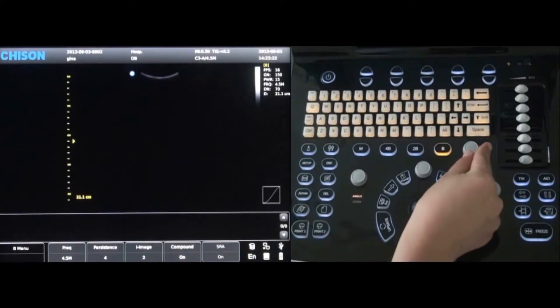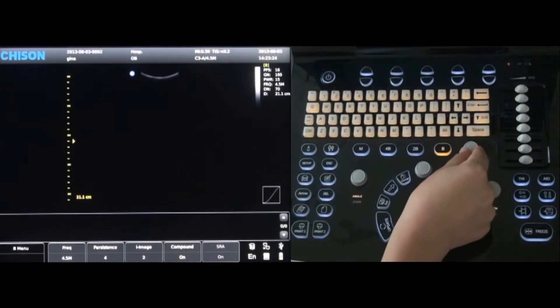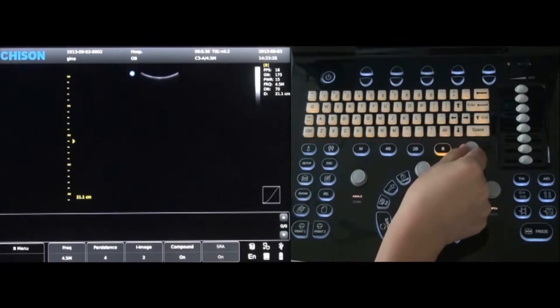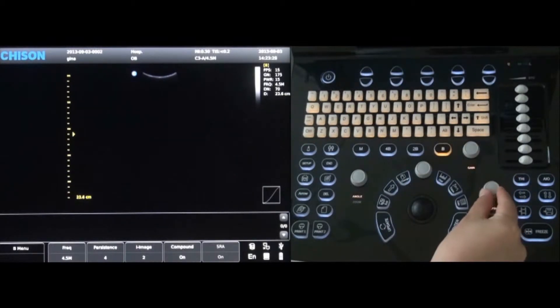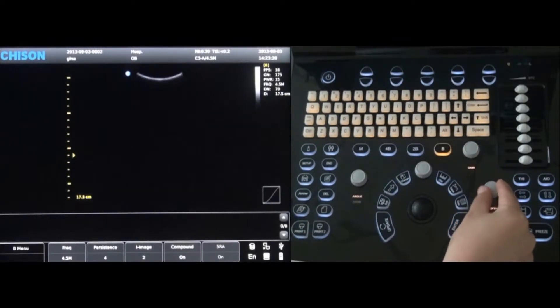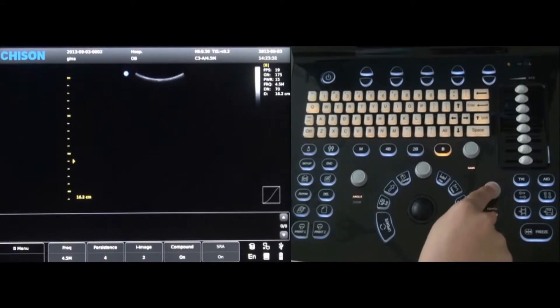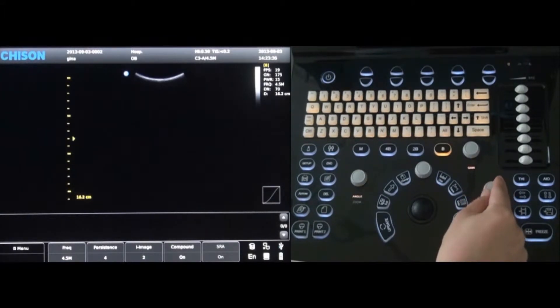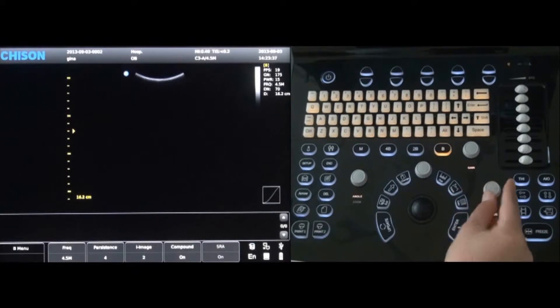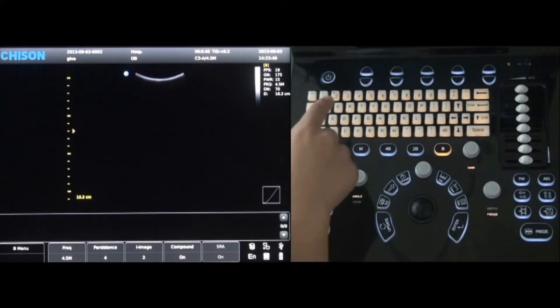To change the gain of the image, rotate the gain control next to the B mode button. The depth can be changed by rotating the depth control below the gain control. To change the focus, simply press the depth control button and it will change to focus control. Rotate the control knob to the desired focus.